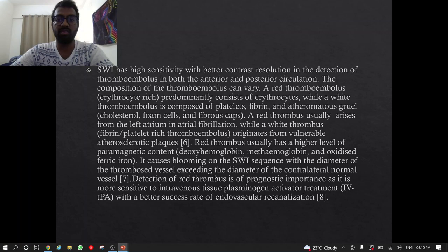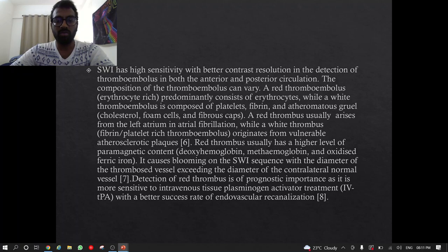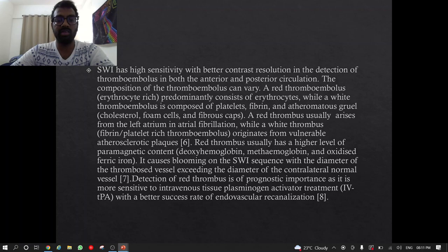SWI has high sensitivity with better contrast resolution in detecting thromboembolism in both anterior and posterior circulation. The composition of thromboembolism can vary: a red thrombus (erythrocyte-rich) predominantly consists of erythrocytes, while a white thrombus is composed of platelets, fibrin, and atheromatous gruel. A red thrombus usually arises from the left atrium in atrial fibrillation, while a white thrombus originates from vulnerable atherosclerotic plaques. Red thrombus has higher paramagnetic content, causing blooming on SWI with the thrombus vessel diameter exceeding the contralateral normal vessel. Detection of red thrombus is of prognostic importance as it is more sensitive to intravenous tissue plasminogen activator treatment with better success rates of endovascular recanalization.